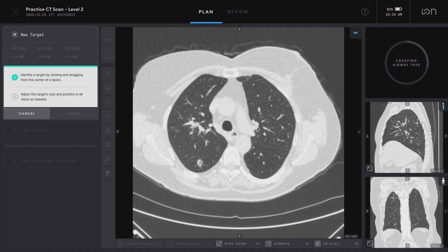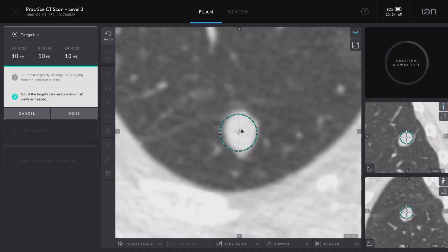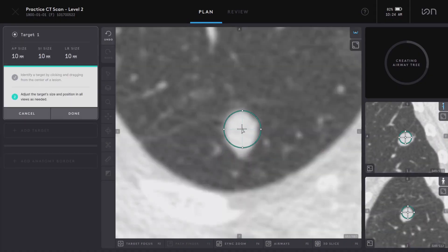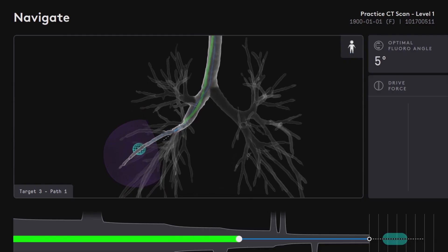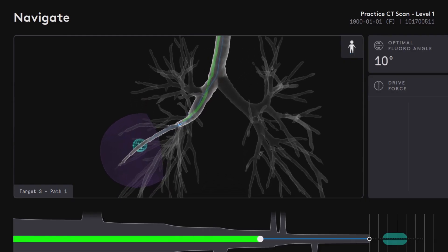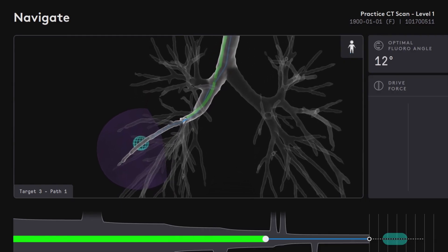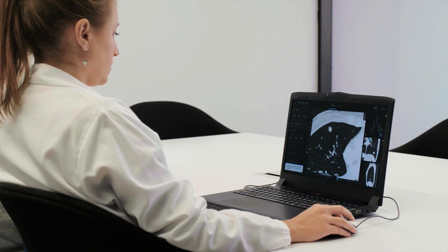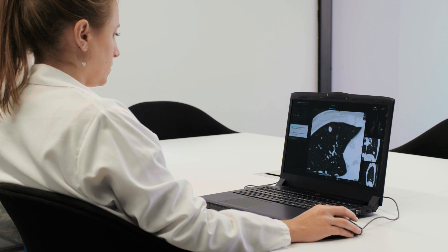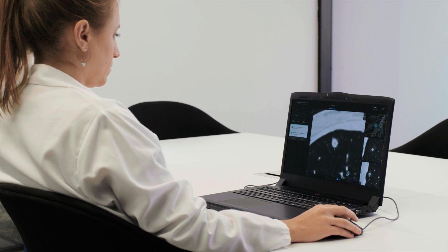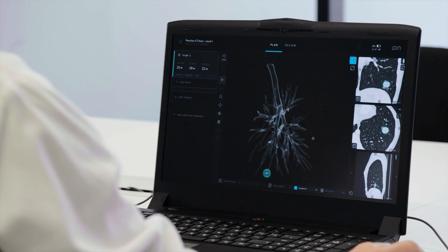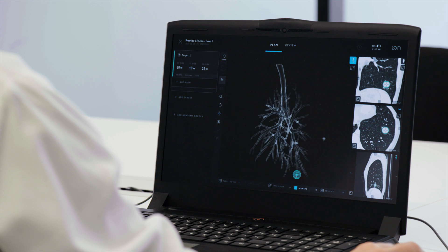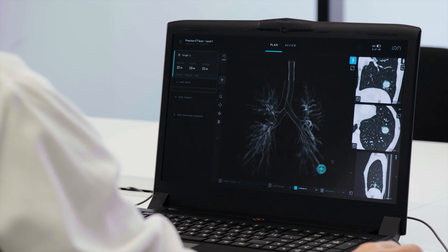The Ion Plan Point software uses patient CT scans to create 3D airway trees of the lung and navigation pathways for use with Ion. A simple user interface allows the user to identify a target and generate a pre-planned path to the pulmonary nodule.